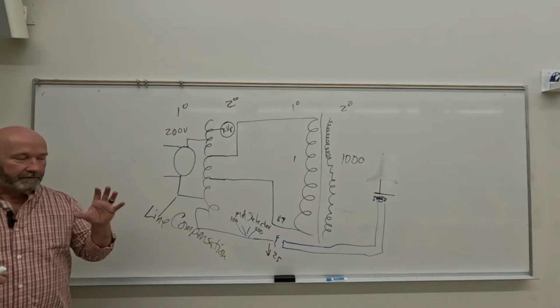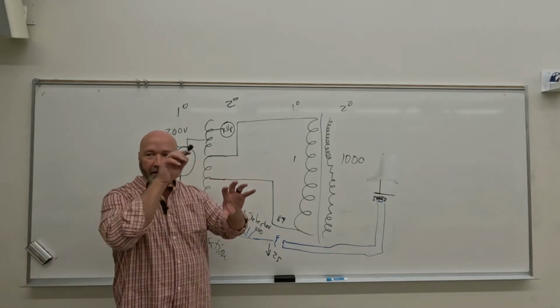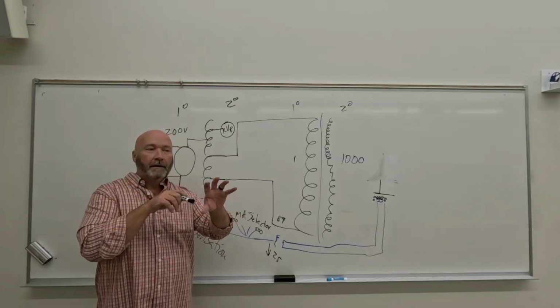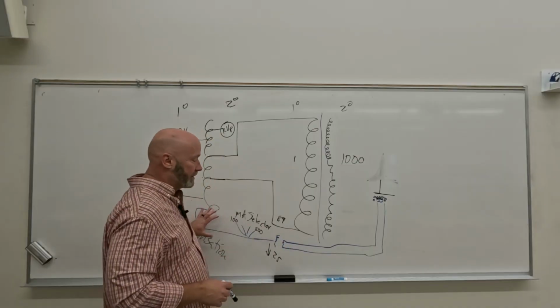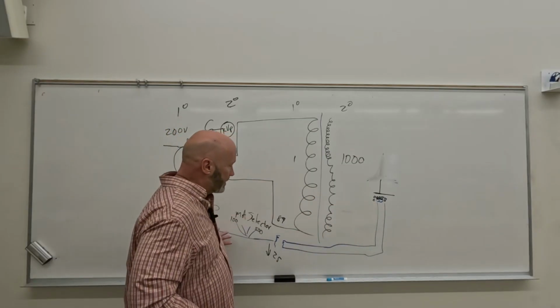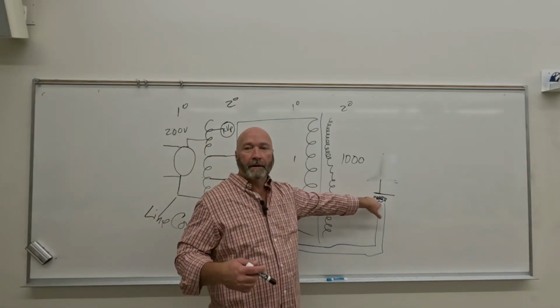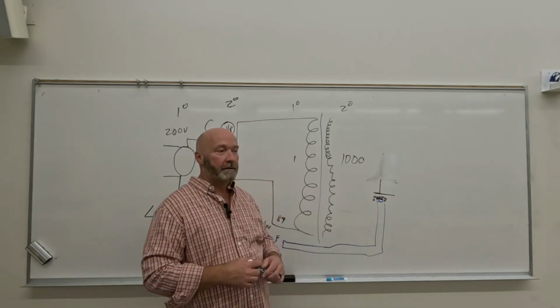So you remember the induction motor I showed you last week. It starts firing off to make that rotor spin around and around and around, right? So you get that, and then you energize. Really the only part of the circuit that you are fully energizing at that point is this lower circuit, so that you start to flow electrons through the filament to get to the point of thermionic emission. Now you're ready to make an exposure.